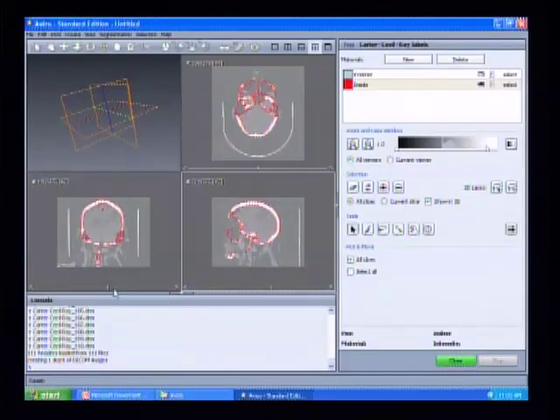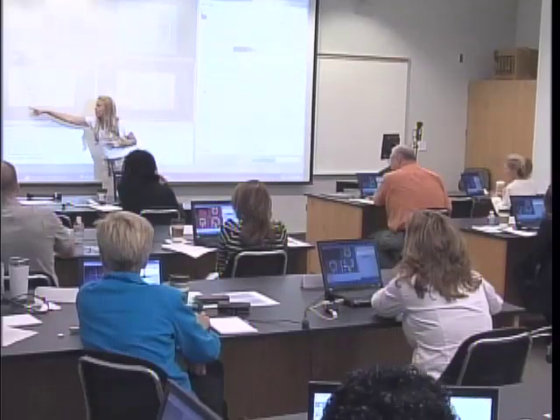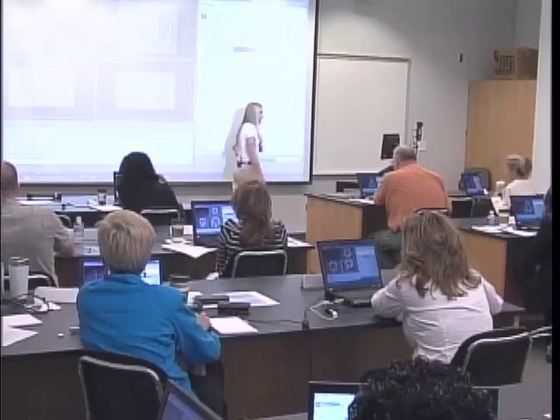You'll also see in the very bottom corner of the bottom left what's probably a piece of the clavicle or some piece of the shoulder. What we want to do now is go through and remove as much of these areas that are not part of the cranium that we're going to be doing the analysis on.